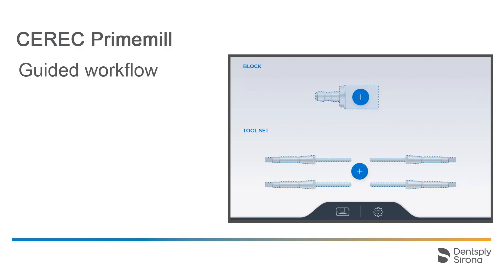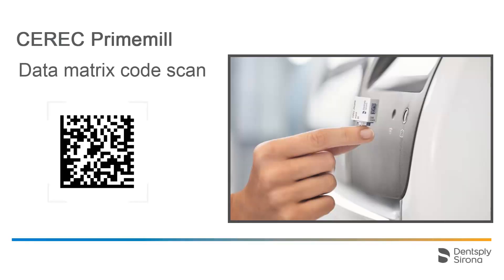To equip the PrimeMill, we start by selecting a block. In our case, we use a CEREC Zirconia block, which is equipped with a data matrix code. The data matrix code contains information about the material, such as block size, color, batch number, and the magnification factor of the block, if applicable.